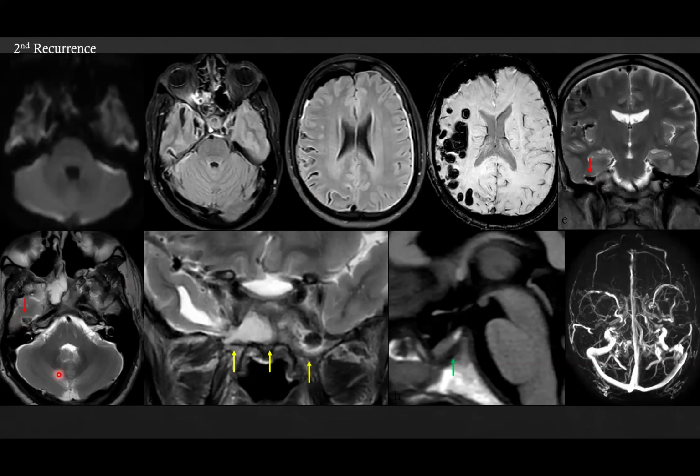So if you look at the images, he has features of intracranial hypotension. Probably the intracranial hypertension which was treated with a theco-peritoneal shunt has now converted into intracranial hypotension, which can be explained by the presence of the shunt. And he also has a recurrence of pneumocephalus. Now probably the site of the leak is from the defect in the tegmen tympani.